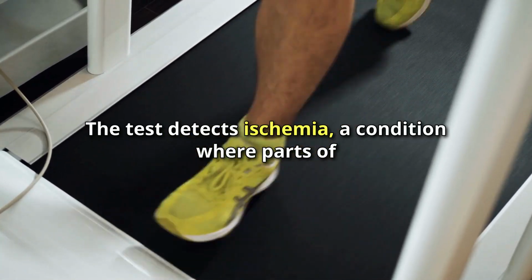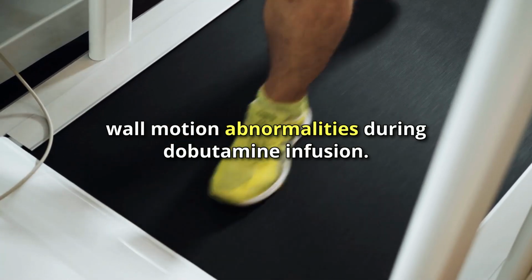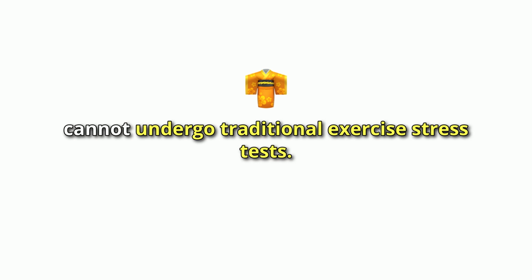The test detects ischemia, a condition where parts of the heart muscle don't receive enough blood flow. This is seen as new or worsening wall motion abnormalities during dobutamine infusion. DSE is especially useful for patients who cannot undergo traditional exercise stress tests.